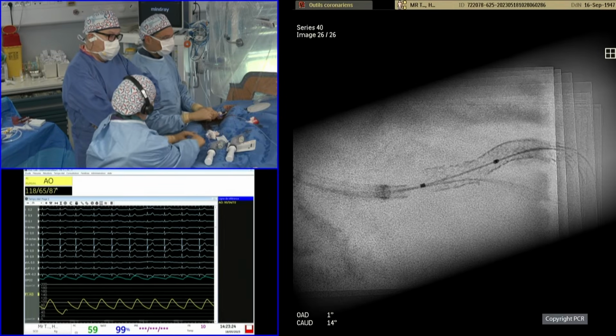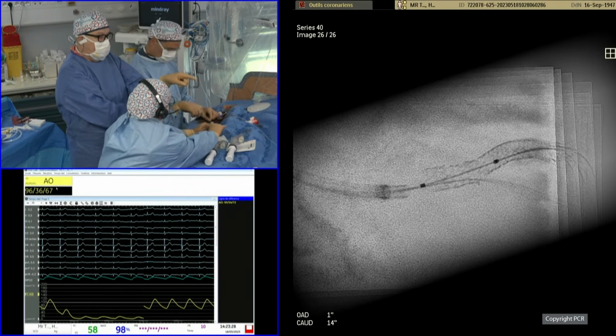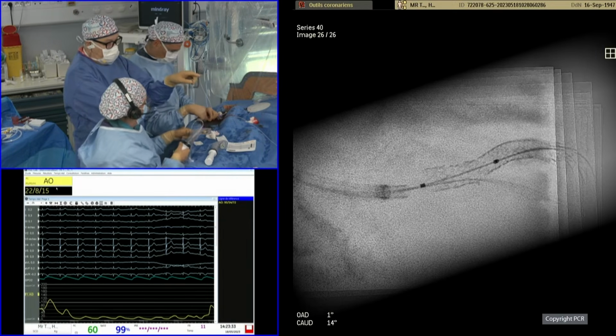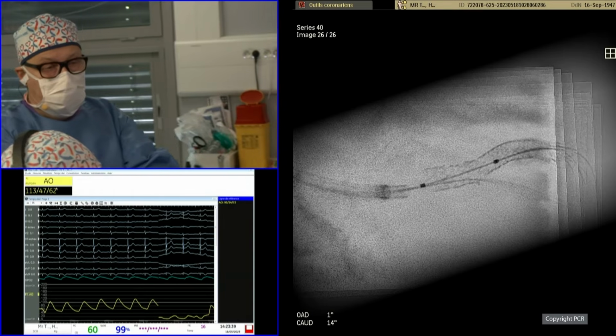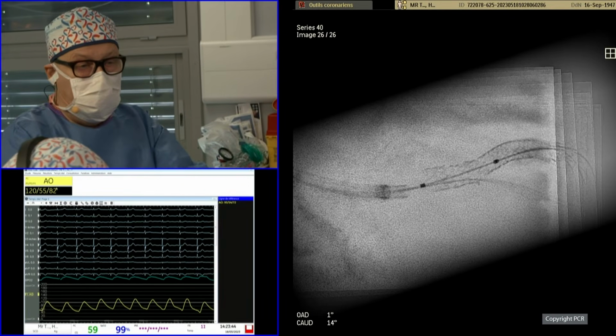Yes, I think totally, if you agree. I can comment briefly on the stent boost. You can see that we have a little bit of scaffolding of the circ with distal wiring after the kissing. You can see that really on the stent boost, and we also see the nice opening towards the circ.